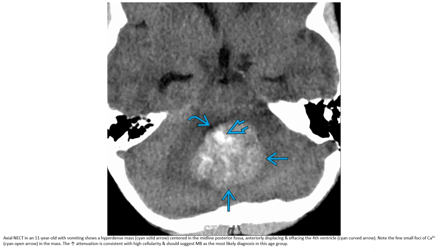Non-contrast CT in an 11-year-old with vomiting shows a hyperdense mass centered in the midline posterior fossa, filling and expanding the fourth ventricle. Small foci of calcification are seen in the mass. The increased attenuation is consistent with high cellularity and should suggest medulloblastoma as the most likely diagnosis at this age.